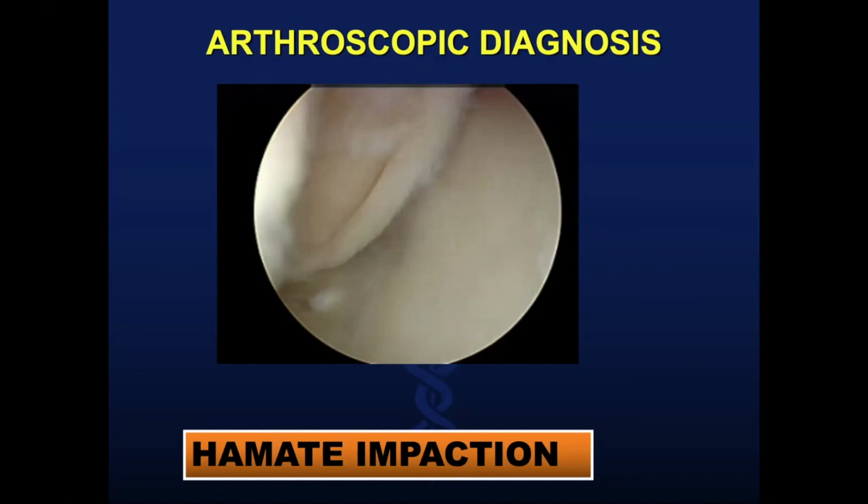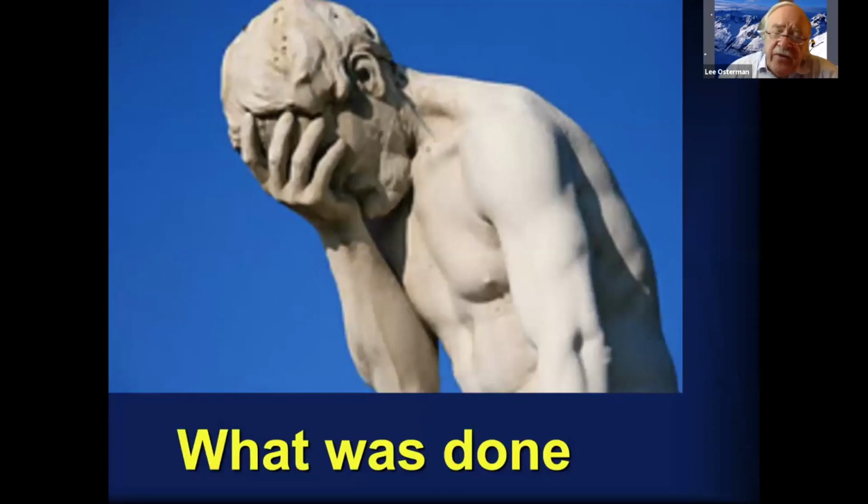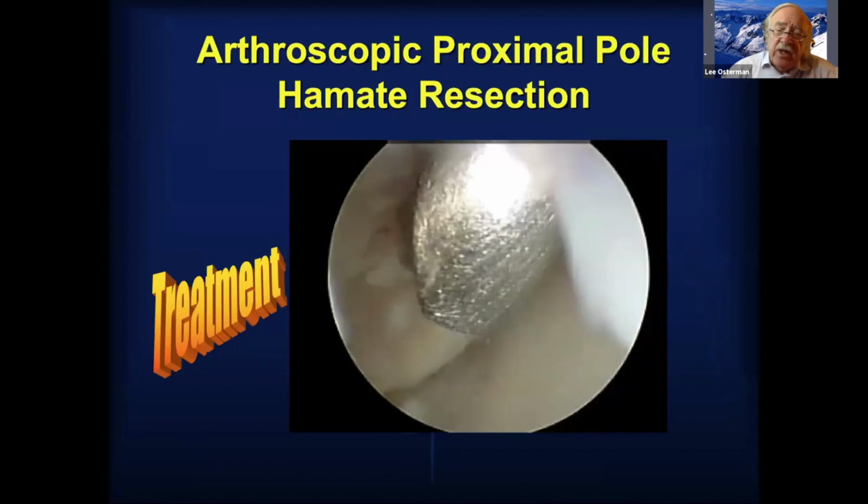One thing though, when I see this, one thing I'm sure to rule out is a hamate hook fracture, because sometimes you can have edema throughout the hamate, and actually it's from the hamate hook, but obviously you have an arthroscopic finding here. Yeah, that's a good point: when you see that kind of edema, it isn't always impaction, and you have to make sure the LT was intact.